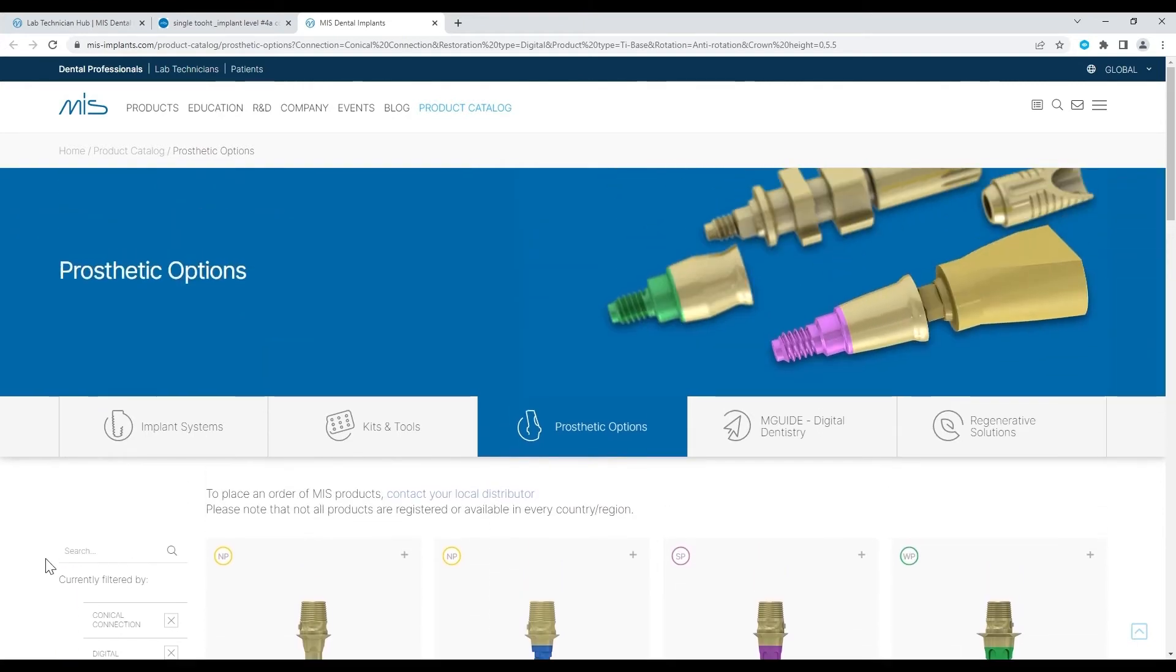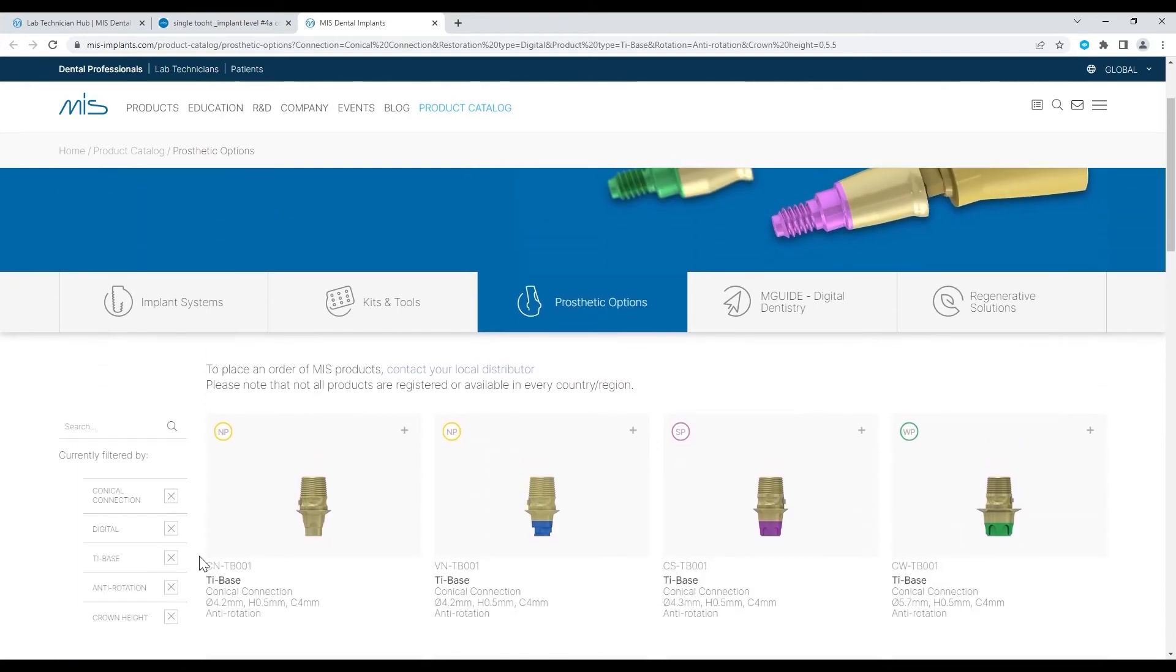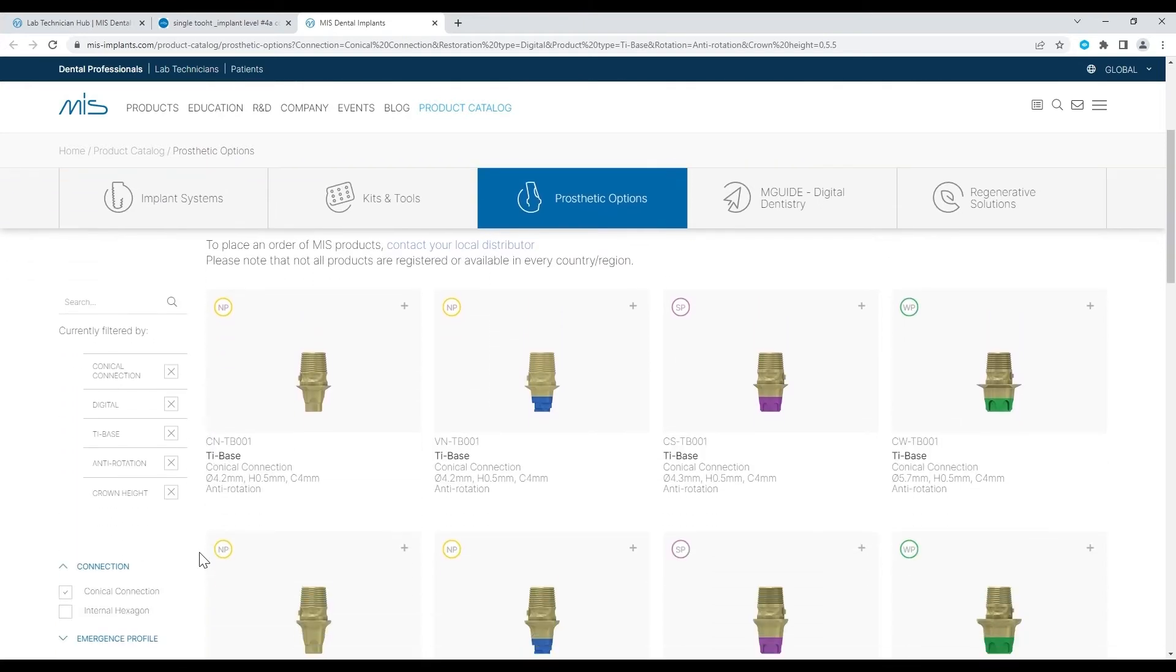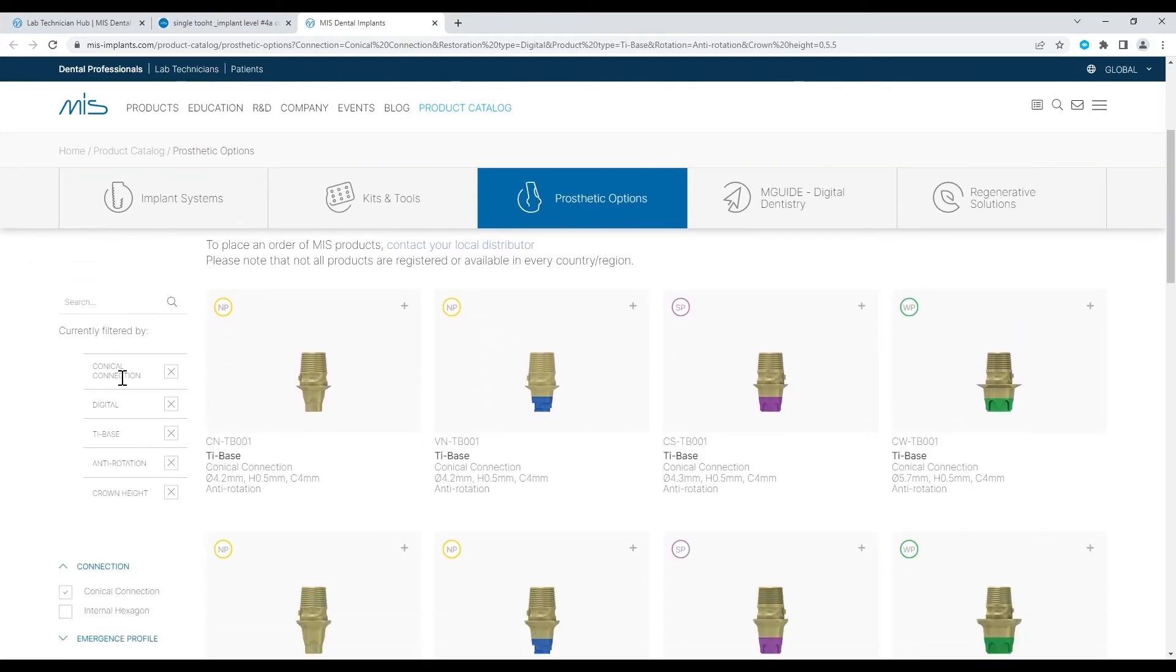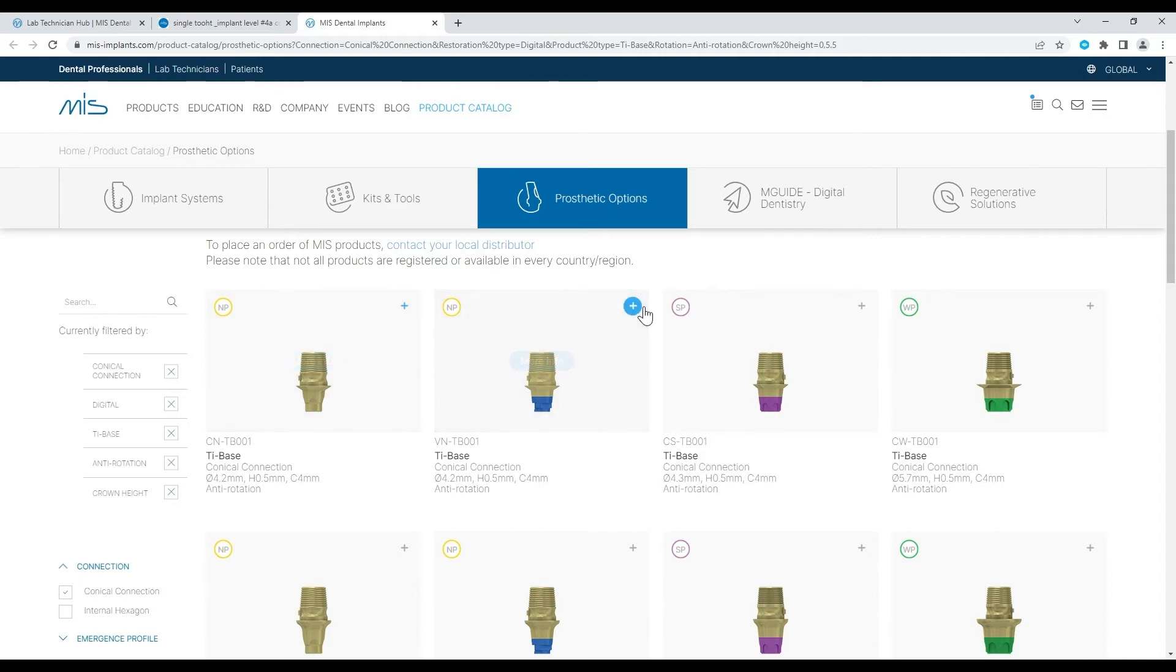In this case, I see all the tie-base anti-rotation conical connection abutments. You may create a list by selecting products and clicking on the plus icon on the right-hand side.